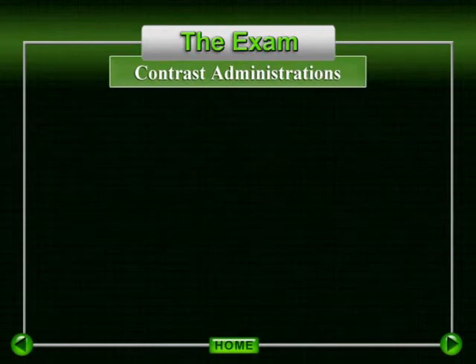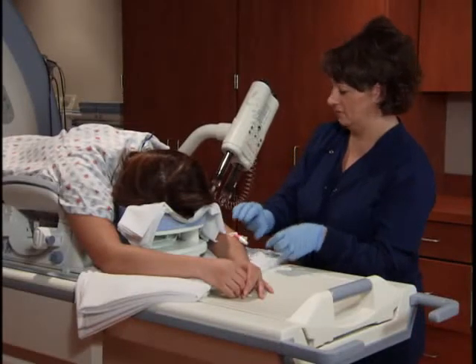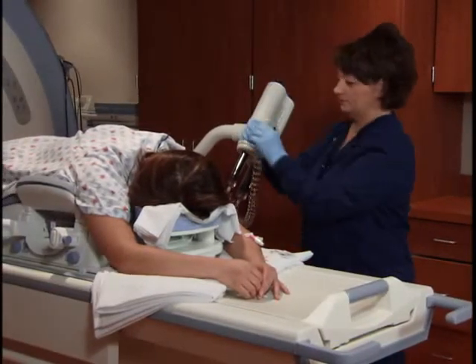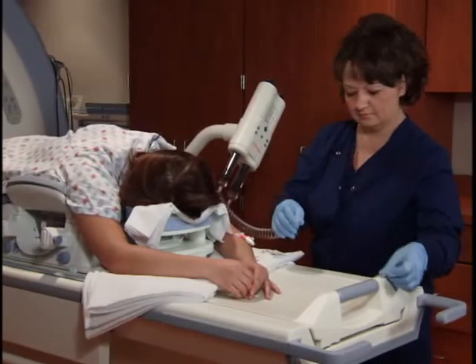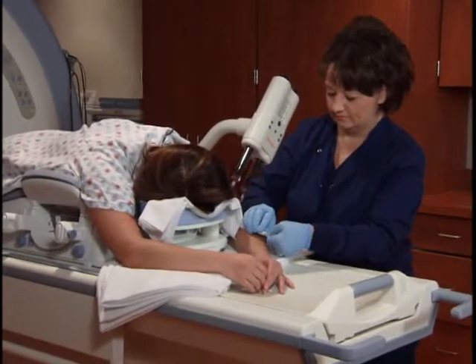The administration of contrast is obviously a critical component to the dynamic breast MRI exam. It is critical that an adequate IV be established for this portion of the exam and that the IV site is closely monitored to assure a complete bolus administration of contrast.